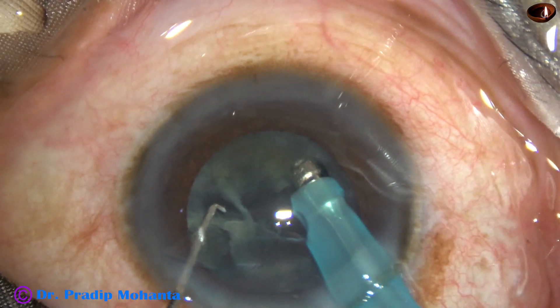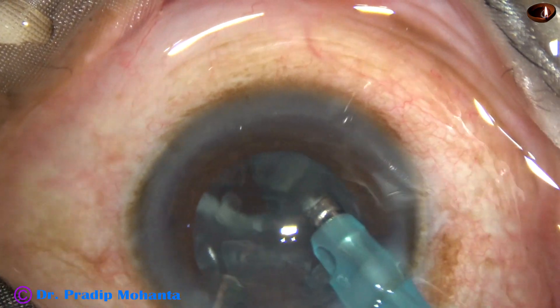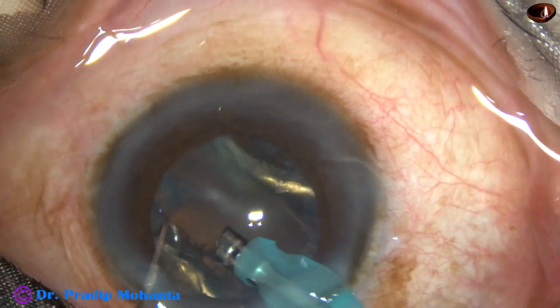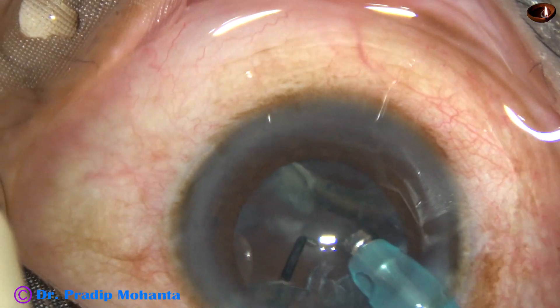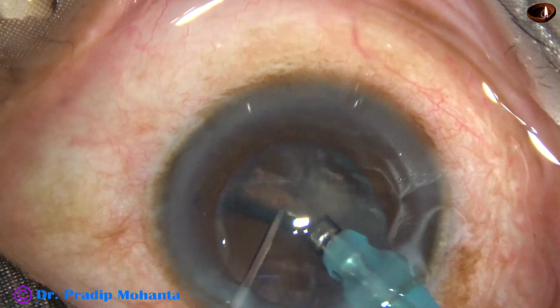We are almost through. Phaco energy — that is ultrasonic energy — in this case is only 40%. Flow rate is 40 ml per minute. Vacuum is 400 mmHg.